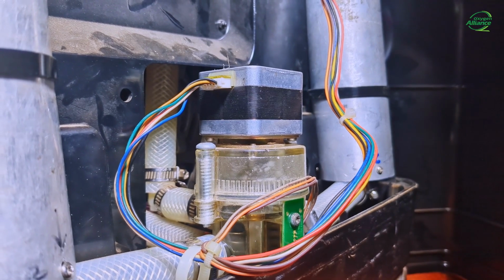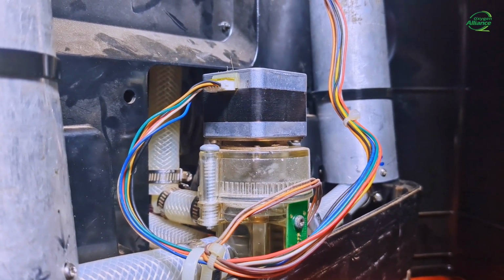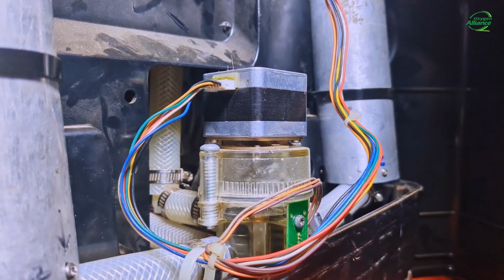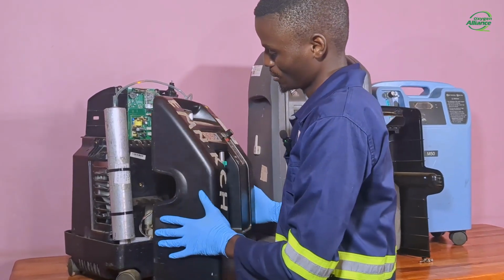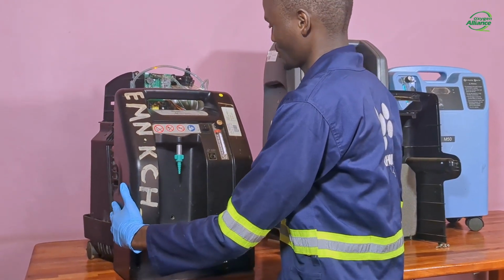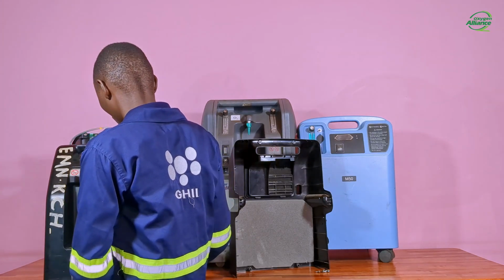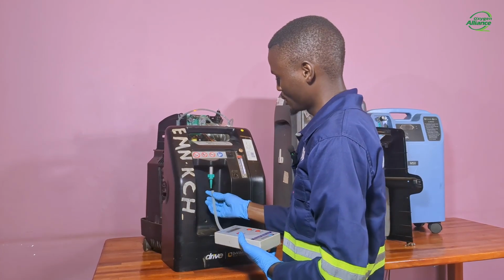I'll wait for some minutes before I measure the purity readings again. So I'll connect the oxygen analyzer and observe purity readings.